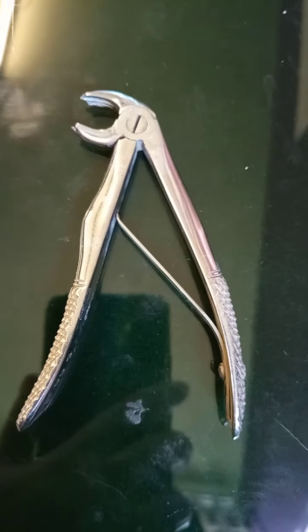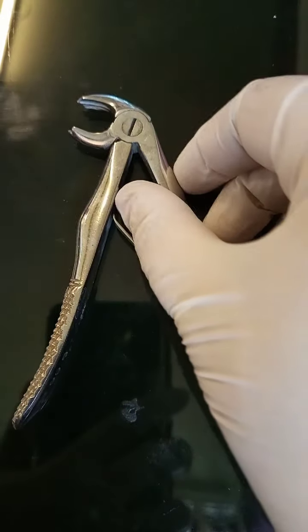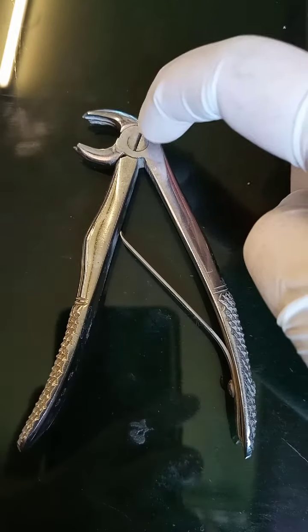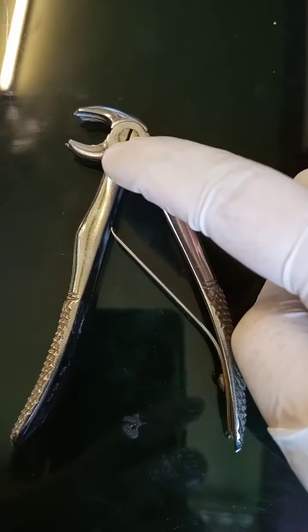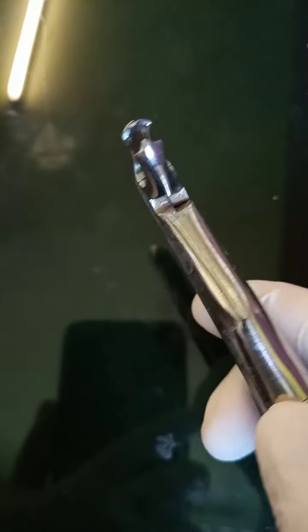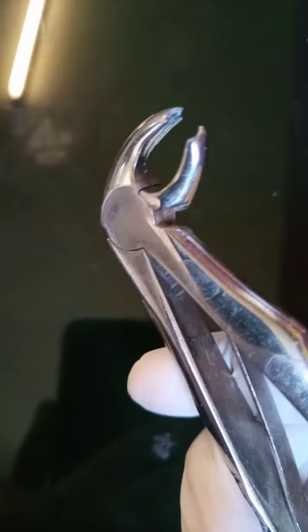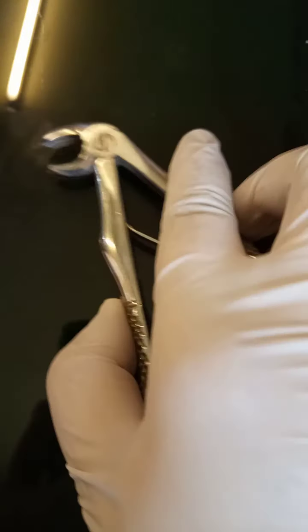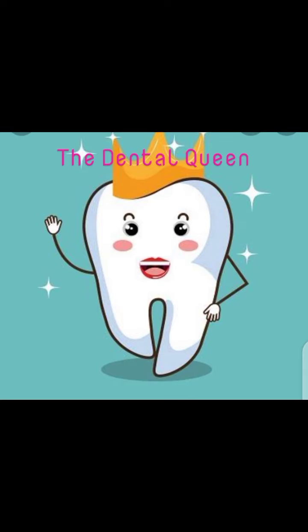Now this is a forceps used for the extraction of lower D and E's. It has same parts: the beak portion, the handle, hinge and the dental spring. It has serrated, pointed end beaks, and it is used for the extraction of lower D.